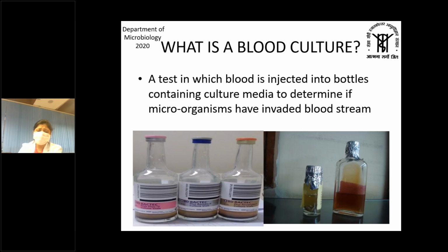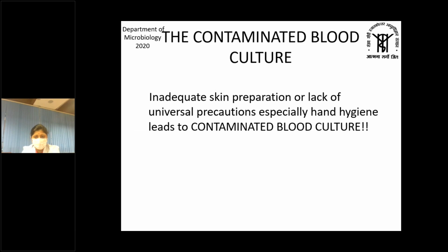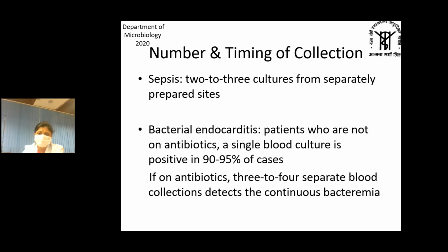Though fungal culture bottles are available, we do not have them at our institute. But for candida infections, the blood has to be inoculated in the aerobic culture vial only. So what is a contaminated blood culture? Inadequate skin preparation or lack of universal precautions, especially hand hygiene, leads to a contaminated blood culture. I'm not sure if I have time. I'll run this blood culture sample collection video at the end of the slide. If there is time, you can see it.